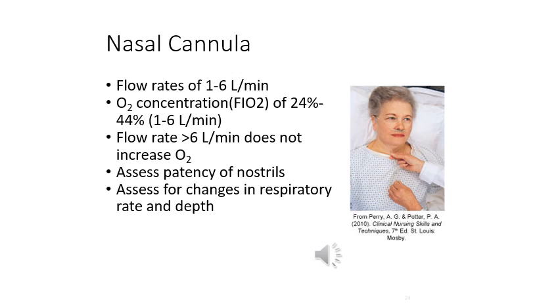If there is any kind of irritation, you can use a water-soluble jelly. And then also remind your patients that they need good mouth care whenever they're on oxygen as well.